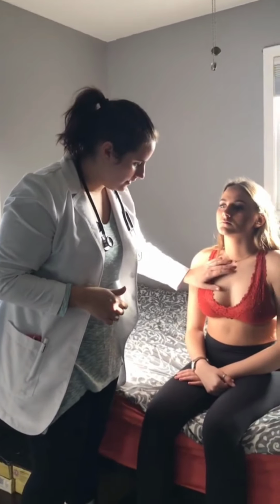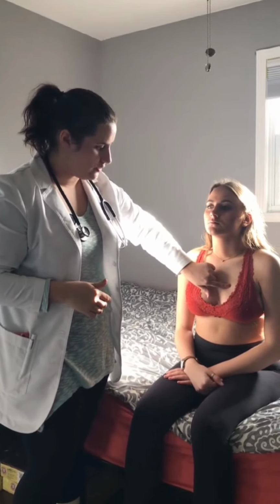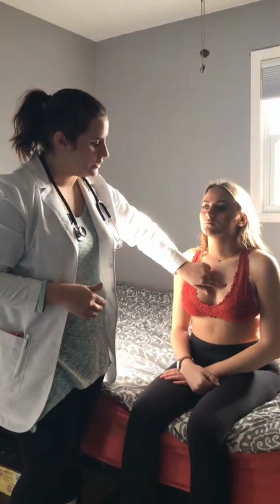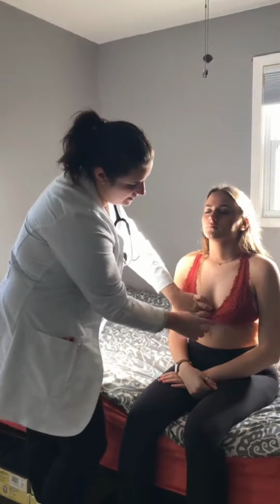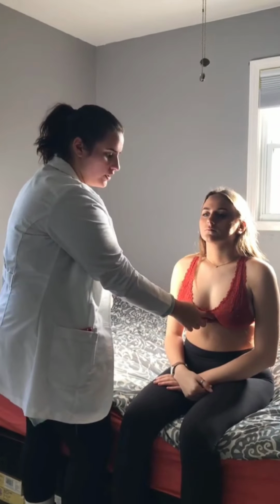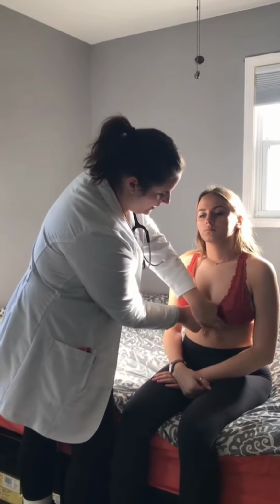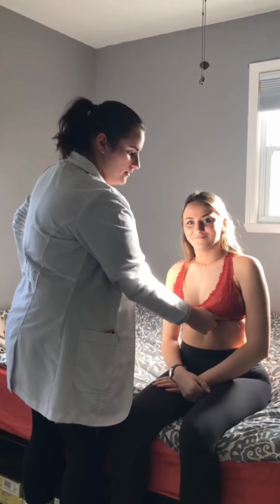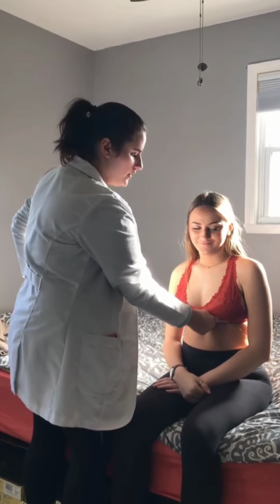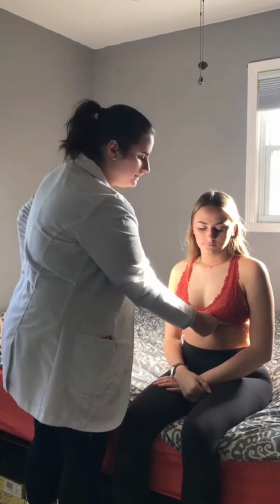If you go down one intercostal space to the third, so let's see, down from the angle of Louis, that's our Erb's point that we're gonna listen to. If we go down two more, which is right here, it's still on that left sternal border. That's the tricuspid valve that we're gonna listen to. And then if we slide over mid-clavicular, right underneath the breast is the mitral valve, at the mid-clavicular line, 5th intercostal space. We're also going to listen to the apical pulse here.